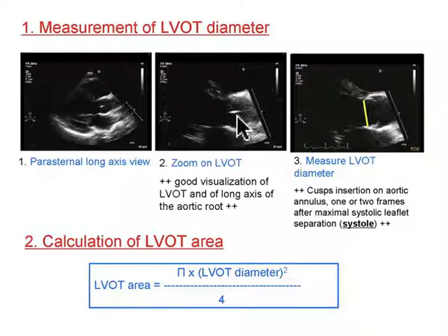The leaflets are together. So in that frozen state, you can then take the dial, the bottom left-hand button, and rotate that dial counterclockwise, and you'll back up to where end systole was. And those valve leaflets, you'll watch them just kind of march right open. And once they're open at their maximal point, you can take a measurement using the calculations functions between those two leaflets, and that's your LVOT diameter, your left ventricular outflow tract diameter.